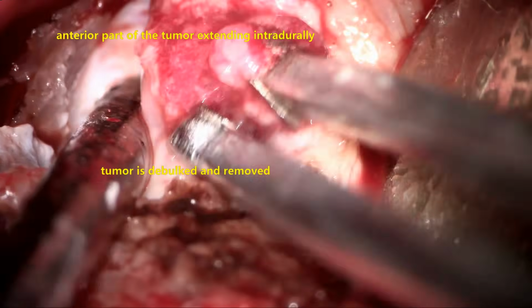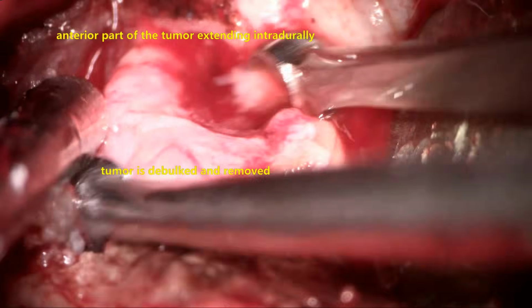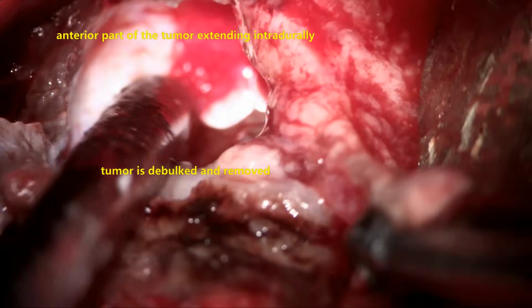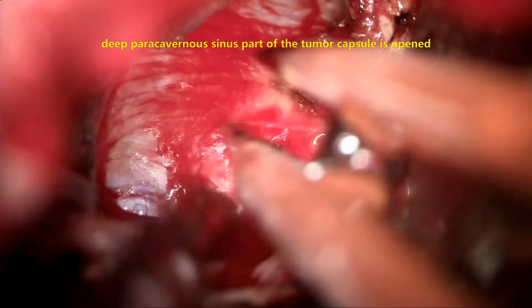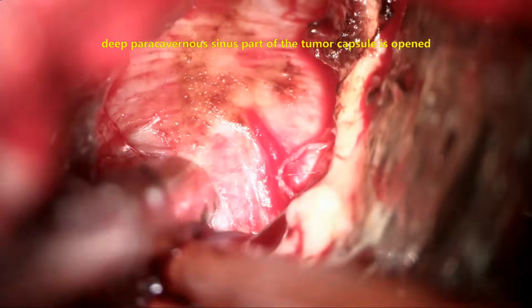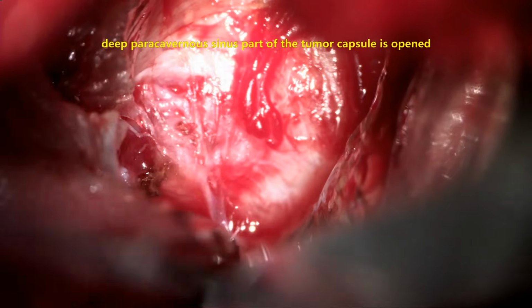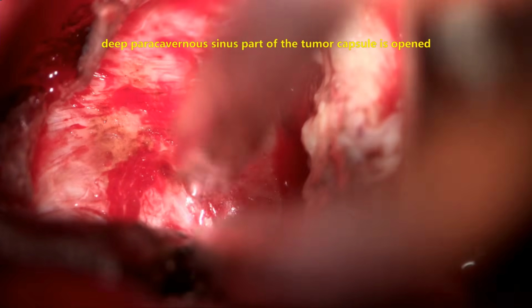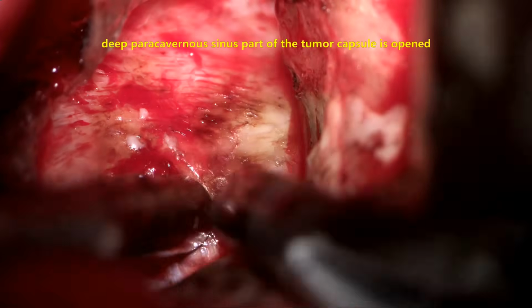That is the basal, anterior part of the trigeminal schwannoma. Intratumoral debulking is done, and that is the adherence of the tumor to the maxillary division of the trigeminal ganglion. Once the debulking is done, we proceed with the posterior part of the tumor, which is being debulked. The capsule is opened, and on the surface of the capsule you can see the bulge there. Again, the dura mater fuses with the capsule, the basal dura.